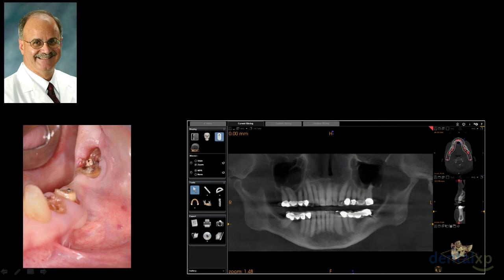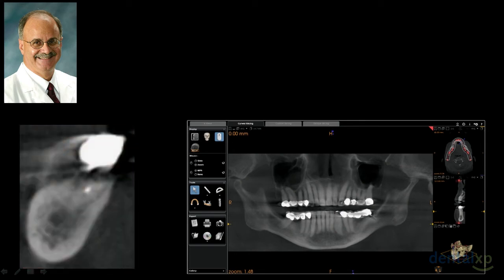And as George Ruelo mentioned, there's no question in the partially edentulous patients, lots of grafting has to be done ongoing. There's no question about that. And fortunately, it's very predictable as long as we follow protocols that have been laid out so well by many, many individuals over the years now. These are predictable protocols. Here, we're going to be extracting these teeth, but most importantly, using, again, cone beam technology, we can assess up front the extent of bone availability.